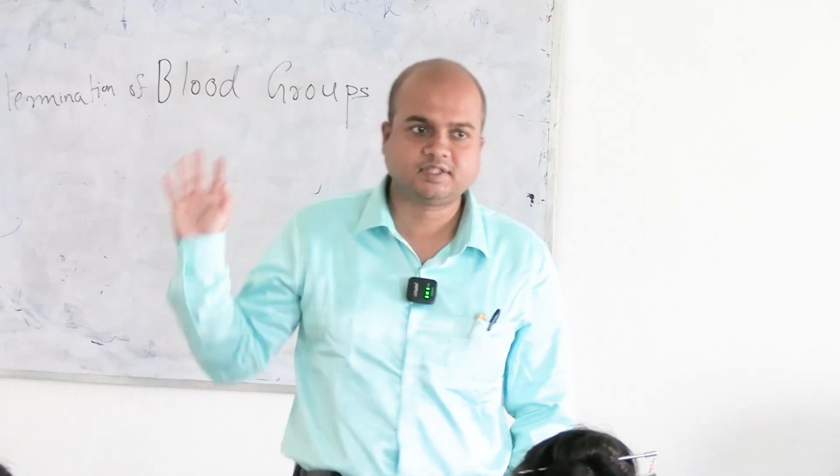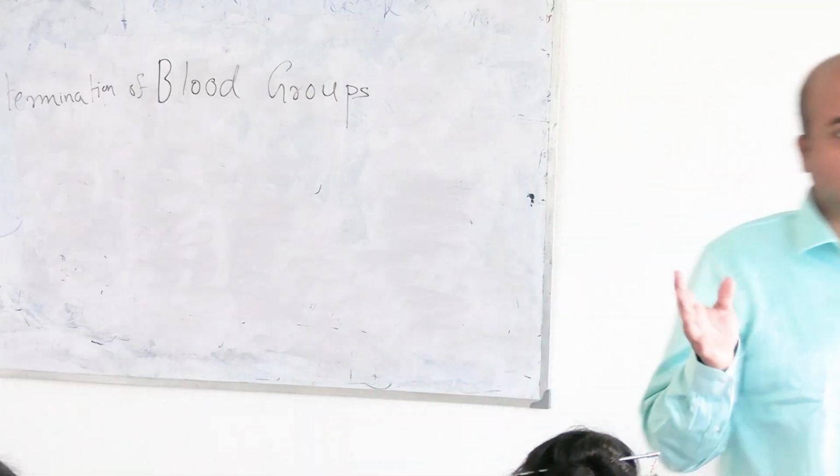Blood grouping has different theoretical aspects, which will be discussed in the hematology theory classes. For the practical part, you just need the initial knowledge about blood groups and blood types, and as you determine the blood groups, it is a very simple experiment. For the examination, when you face the hematology practical exam in this physiology first phase university exam, whenever you perform an experiment, the examiner may ask you questions related to its theoretical aspects.